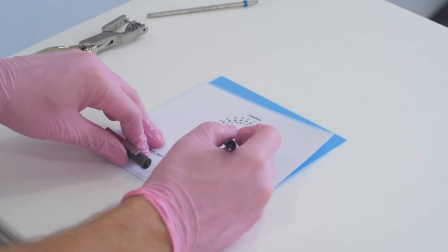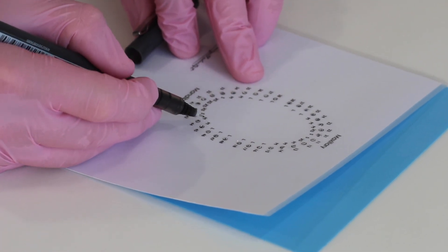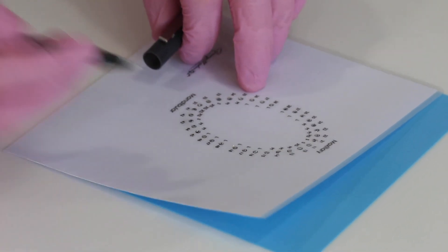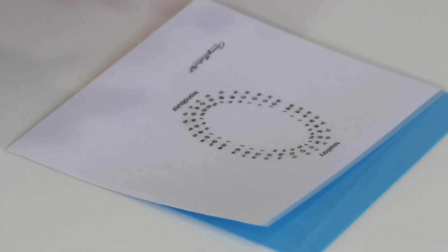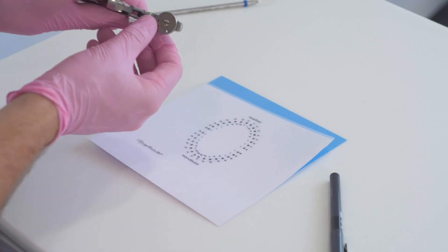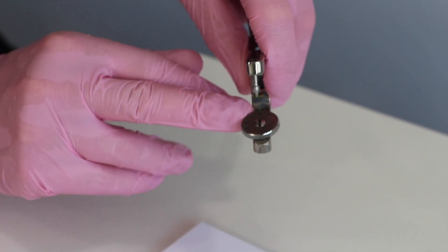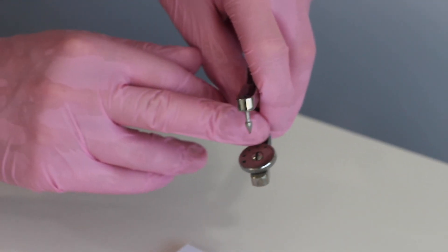Once I've marked up my holes, you can see that the little letters by the stamp indicate the size of the holes you want to punch in the rubber dam. So you can see where it says large, medium, small, extra small. If you have a look at your rubber dam punch, you've got these five holes: extra large, large, medium, small, and extra small.